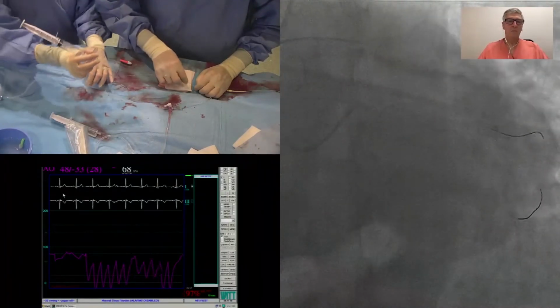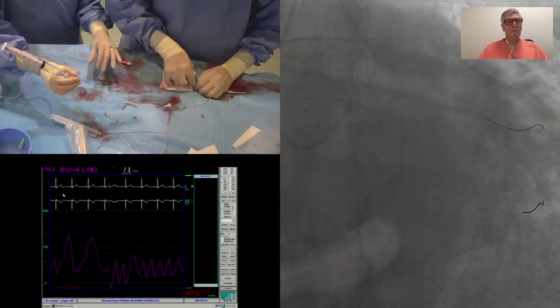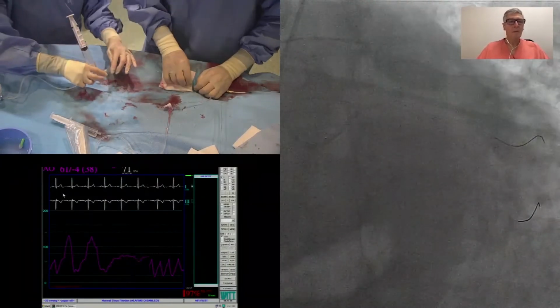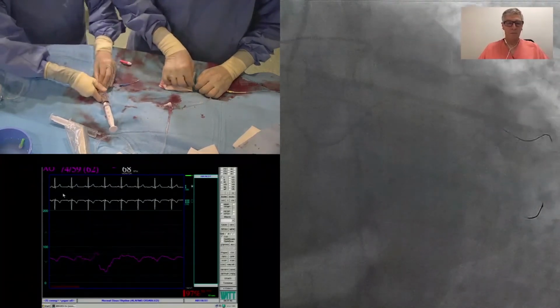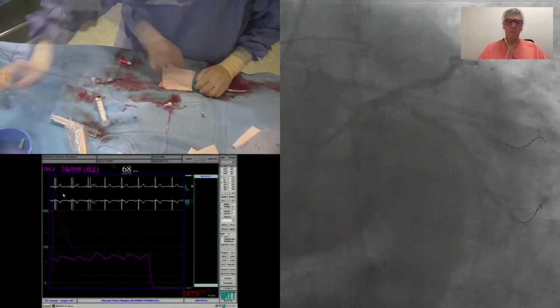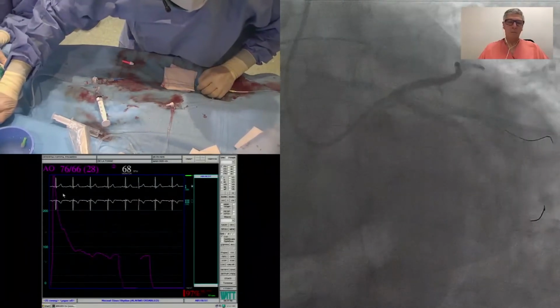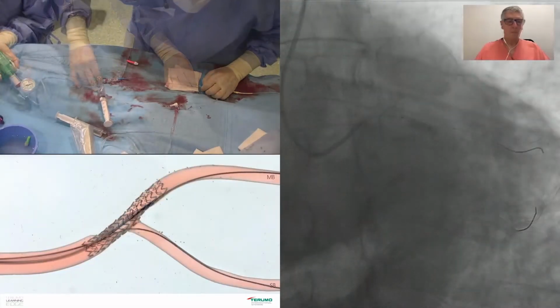We are just placing the balloon, a non-compliant. I repeat, look at its malapposition because now it crossed in. Sometimes it's an indication that you have malapposition proximal and you need the POT because the balloon is crushing against the proximal edge of the stent. This is the point, exactly. We are proximal to the carina.